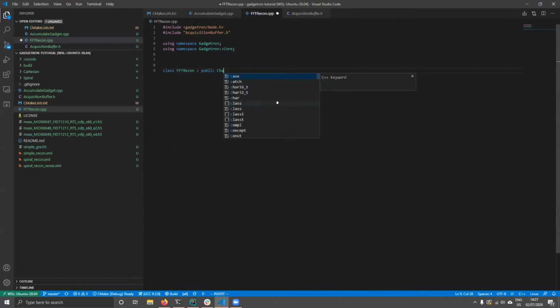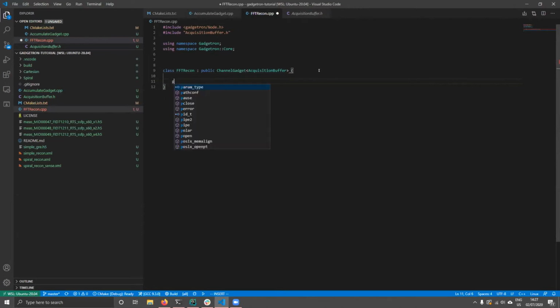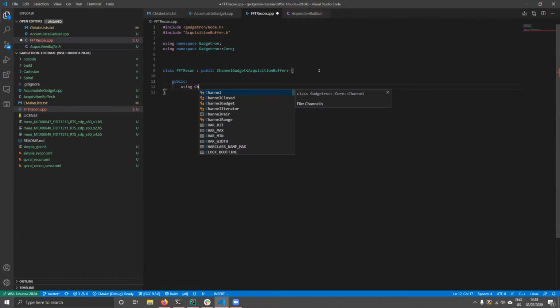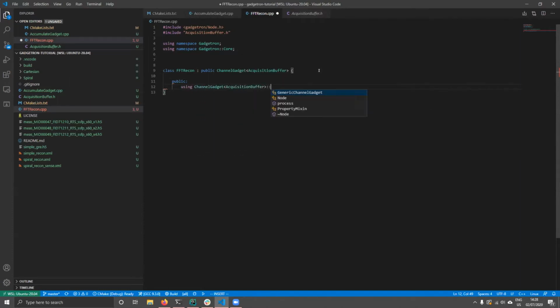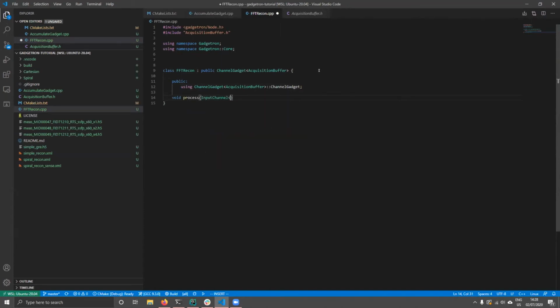So we're gonna make a new class, FT-Recon. It's also gonna be a channel gadget, but this time it's gonna take an acquisition buffer. Our acquisition buffer that we declared right here. We are gonna have a constructor, but we're just gonna borrow the constructor from channel gadget. And we're gonna have process, input channel, as an acquisition buffer, and we're gonna have output channel. And we don't really need to do any pre-processing here, so we just get right into it.